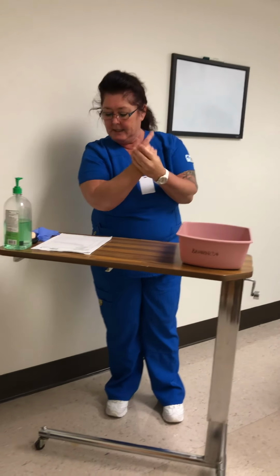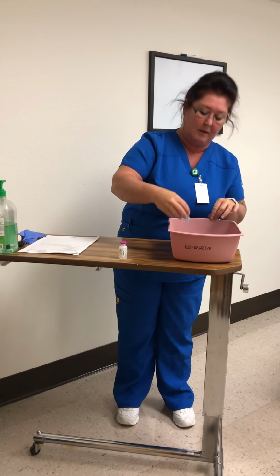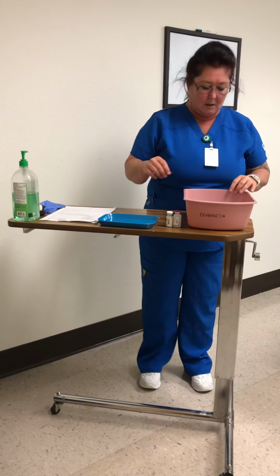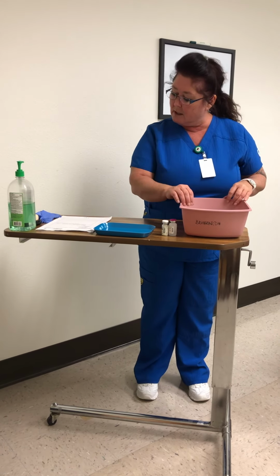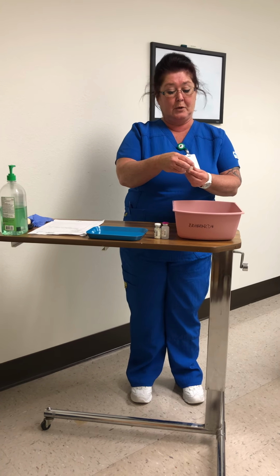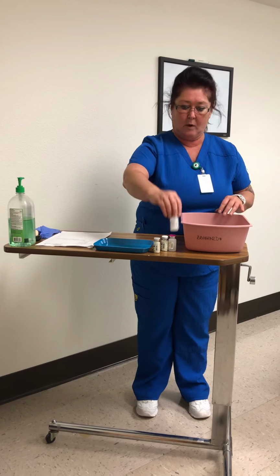And the first one is the PPD. So I am pulling out a sterile water to mix with my tuberculin. And then I have my ceftriaxone 250 milligrams. This is an anti-infective. This is a powder, so that is 250 milligrams. It is going to have to be diluted with the water, and then we will have to perform dimensional analysis. And I have my sterile water for that.